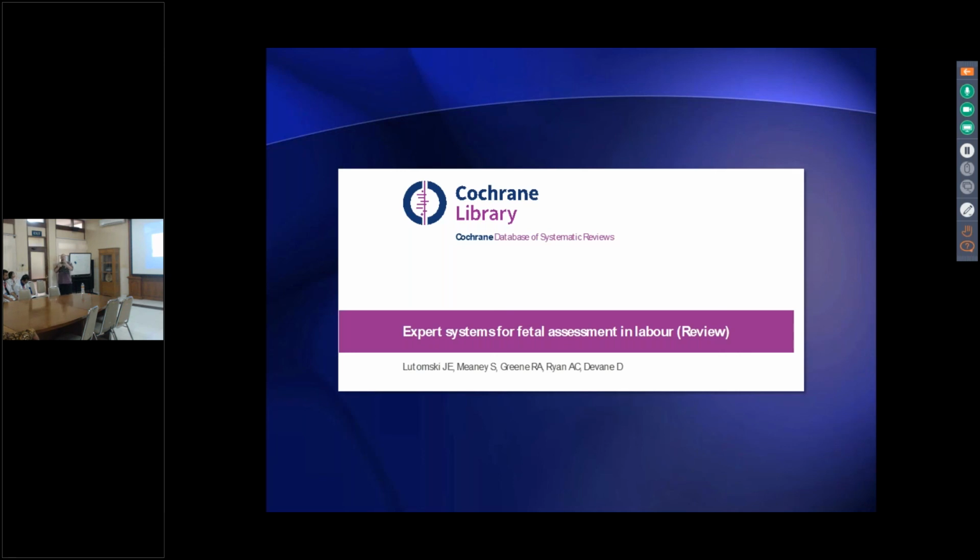A woman called Karen Nelson, N-E-L-S-O-N, has done a lot of work on severely abnormal CTGs, looking at late decelerations with reduced variability and at the predictive value of those severely abnormal tracings for the development of cerebral palsy. Most of those tracings, the infants will not end up with sufficient insult to develop cerebral palsy.